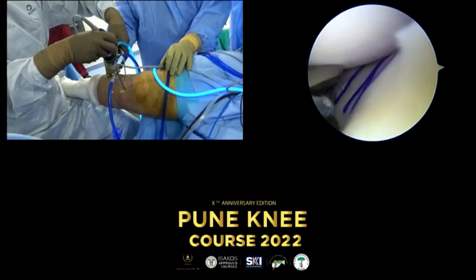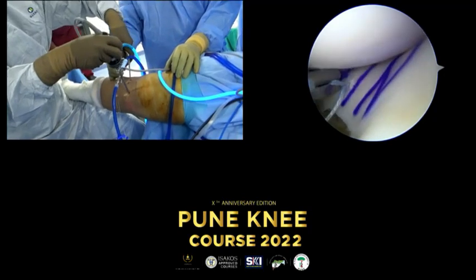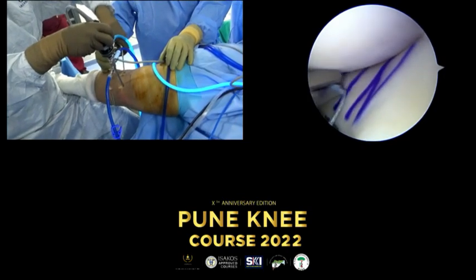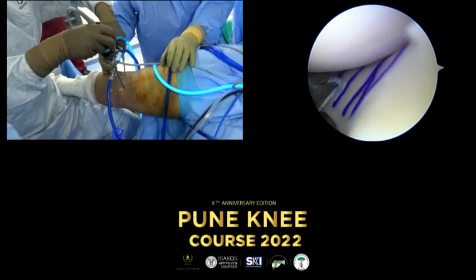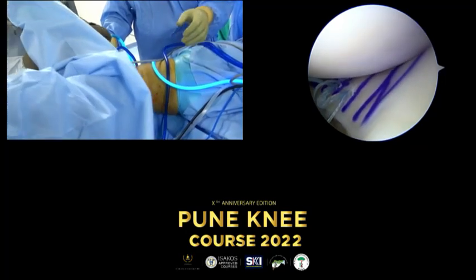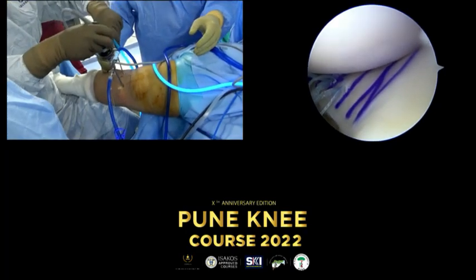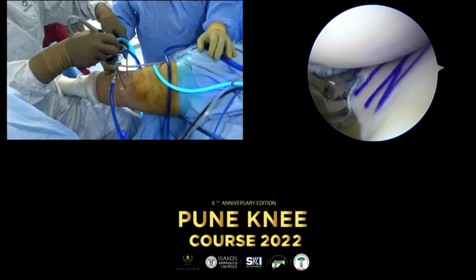Yeah, I usually use a spinal needle to do it. I tried to do it before. This is not cutting. Do we have something that is cutting? Yeah, some cutter. The graft always goes up. Always goes up. So that's why we have that reduction suture, keeping it down.